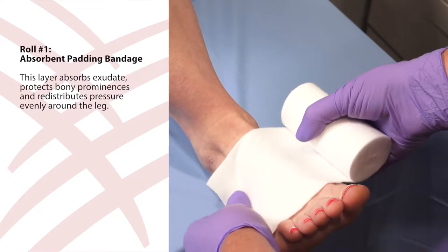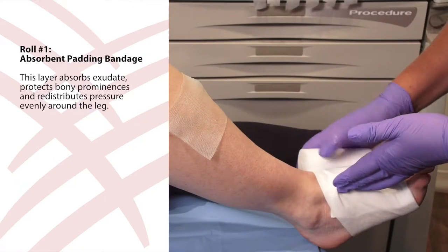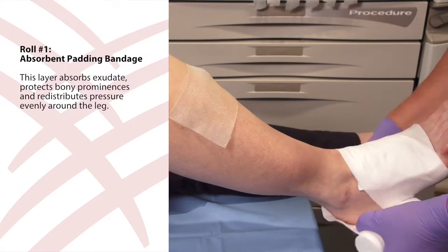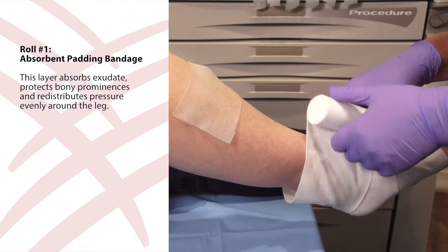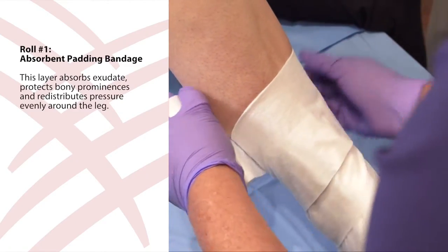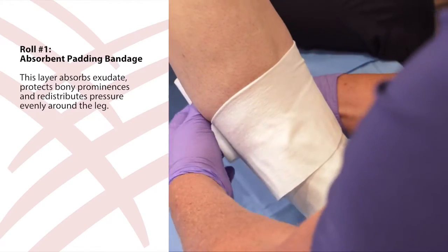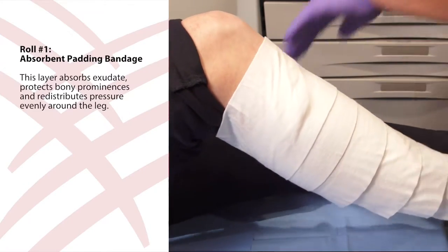Ensuring that the foot is flexed, apply roll one, the absorbent padding bandage, as smoothly and evenly as possible without stretching. Start at the base of the toes and give the bandage anchorage around the foot with two wraps. Work up the leg behind the Achilles tendon to ensure the heel is covered. Apply the padding in a spiral technique, ensuring a 50% overlap. Work up the leg and finish just below the knee. Tear or cut any extra bandage.